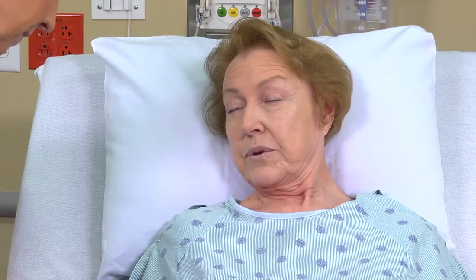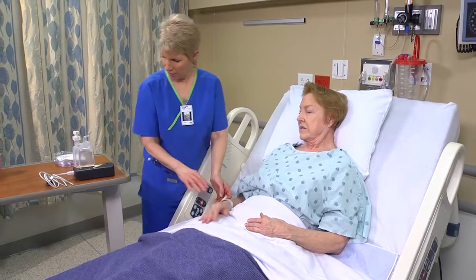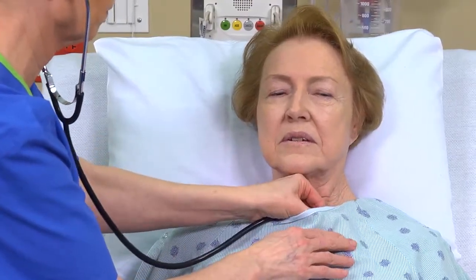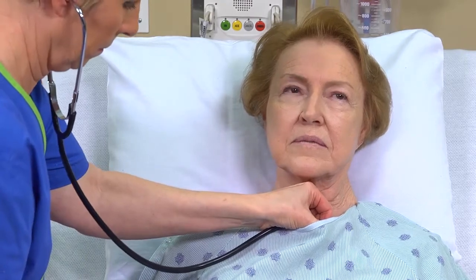The patient responds: 'Beverly Hampton, and my birth date is January 8, 1948.' Then assess the patient's respiratory system and obtain her oxygen saturation and pulse.